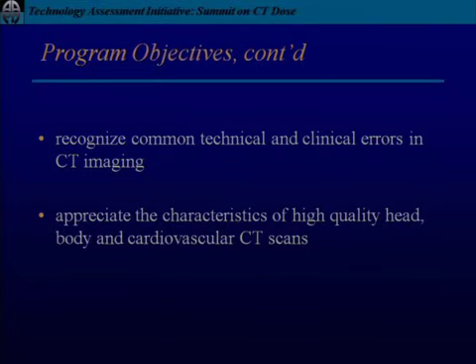We consult for a very large facility that will not consider helical scanning for routine head protocol because they refuse to scan through the lens of the eye. I'm just curious your thoughts.